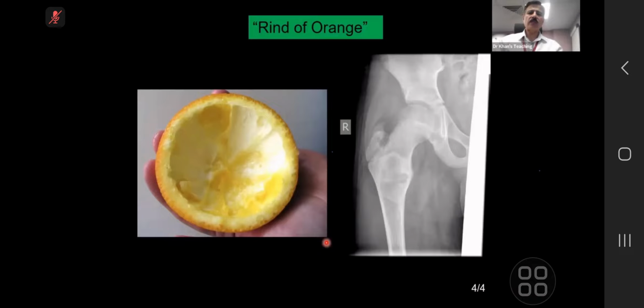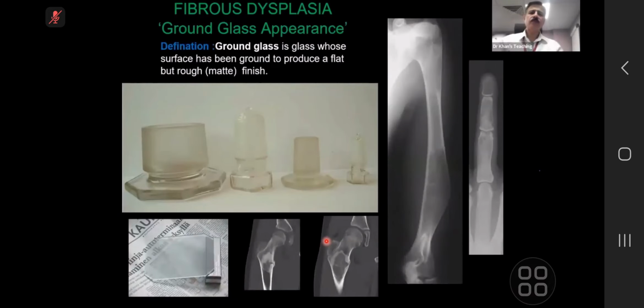So let's go back to the basics and consider the concepts of fibrous dysplasia and what kind of films can come in the exam. It is one of the most favorite pathologies to be shown in the exam. And even it is shown in head and neck, for example, or skull and CNS. And if you know the pathology, you can make your radiology.